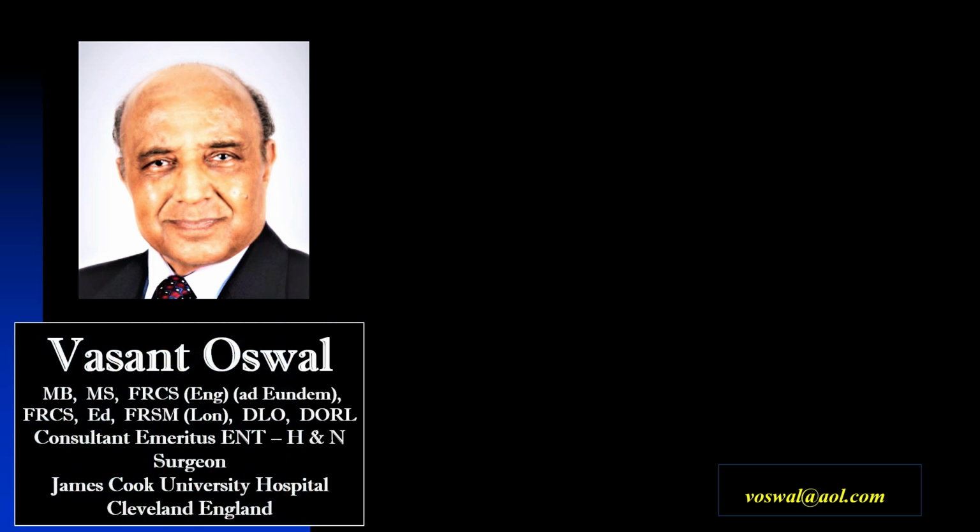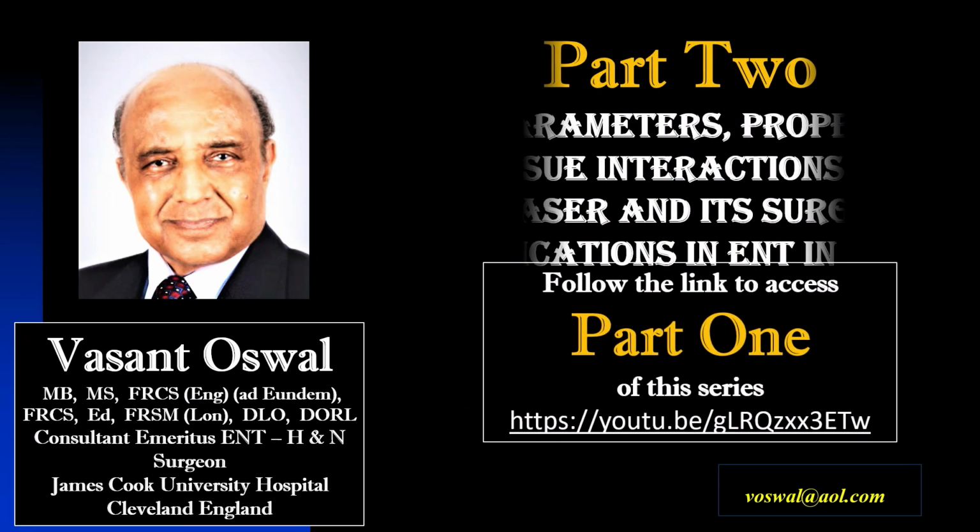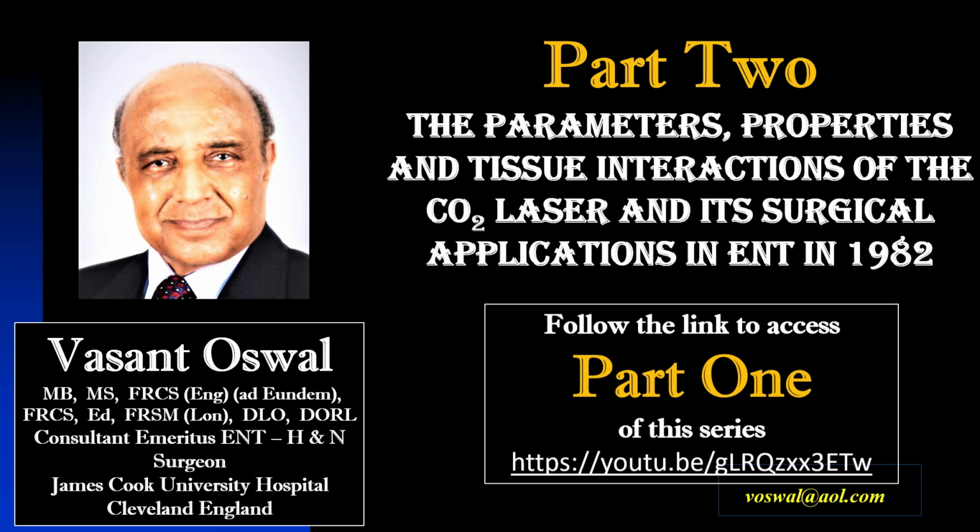The basic physics involving the development of the lasers has been covered in part 1 of the series. So those who are interested, please check it out. Here, part 2 covers parameters, the properties, and the tissue interactions of the laser technology using the CO2 laser in the ear, nose, and throat surgery. This part covers surgical demonstrations and viewer discretion is advised.